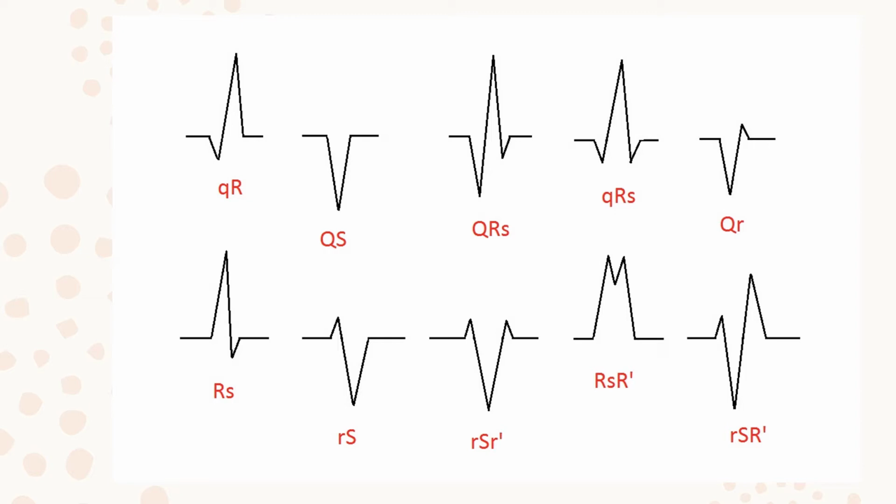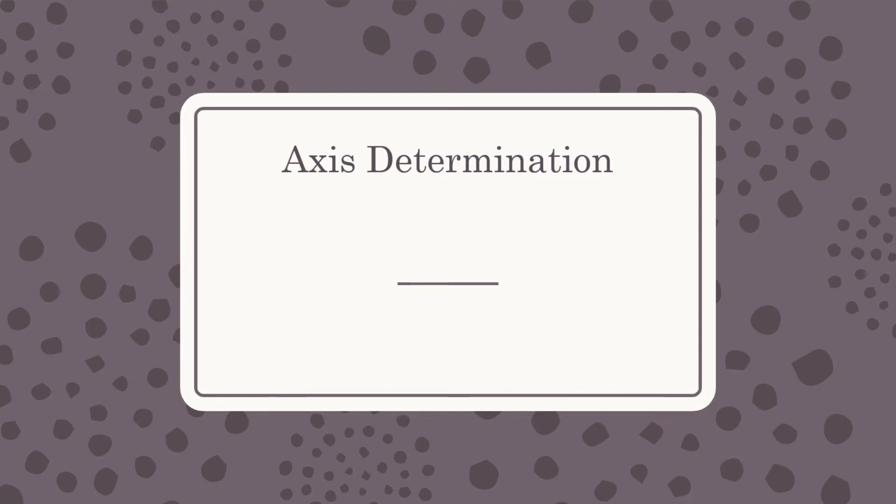And if we go back to my analogy of driving and say there's construction on the road and you have to take a detour, that's what we're seeing here. We're seeing the electrical activity have to take a detour around an area of inactivity, basically. So remember about electricity. The electricity in our bodies, generated from our hearts, think about where that is coming from. It's coming from the SA node, right? In the normal person, with a normal heart. Well, even if there's abnormal, but let's just go with this for the moment.